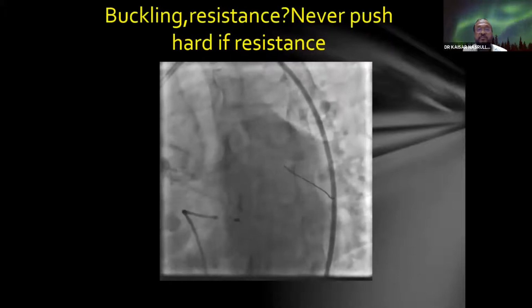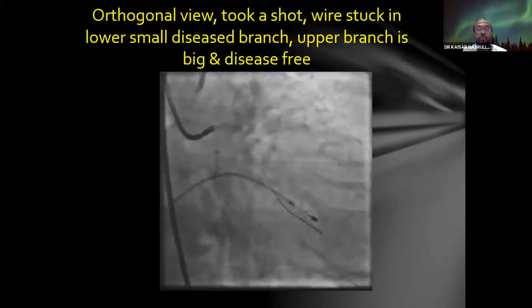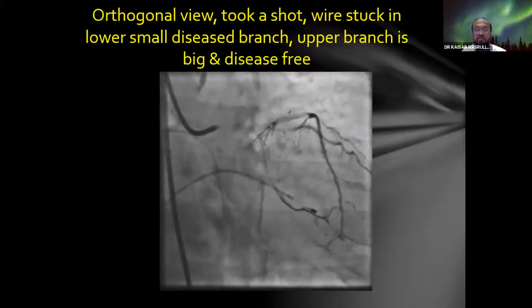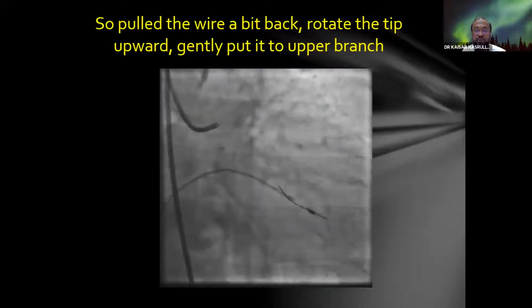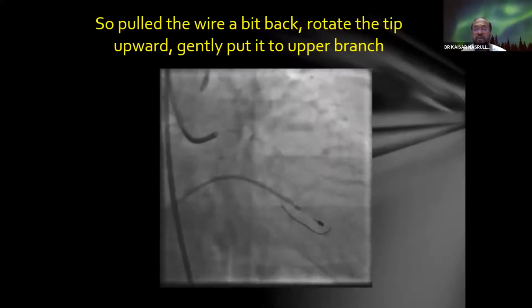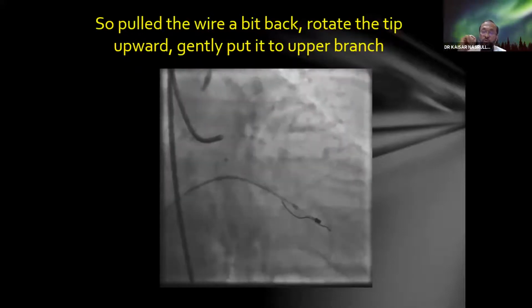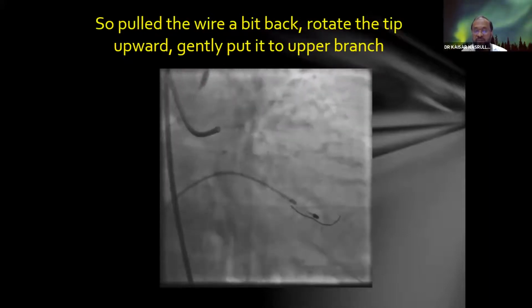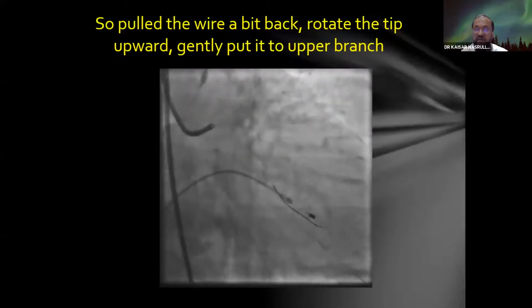Then you can see the wire tip is now getting some resistance. So I took orthogonal views and a picture to see where the vessel is, where it is stuck in a small vessel. When it is stuck, just pull out the wire and make the tip free, rotate upwards, and then go to the main vessel gradually, like this. Whenever the wire is stuck, never push with force. If you push with force, there will be dissections. So if the wire tip is buckling, pull out the wire, rotate the wire tip in another direction, and gently move forward.